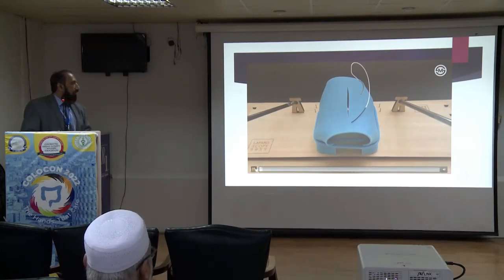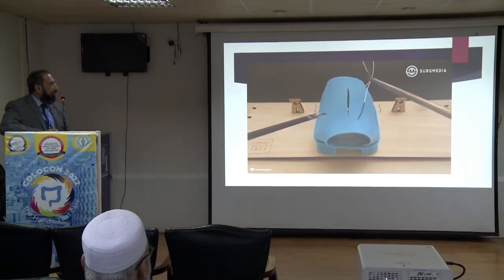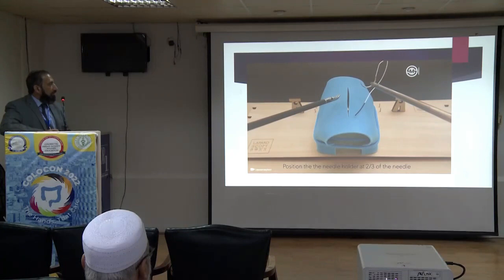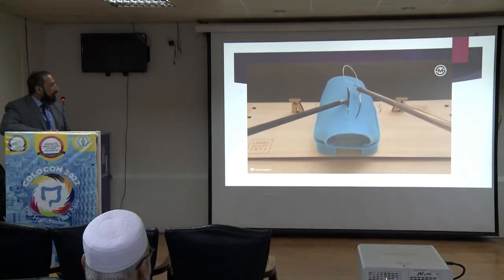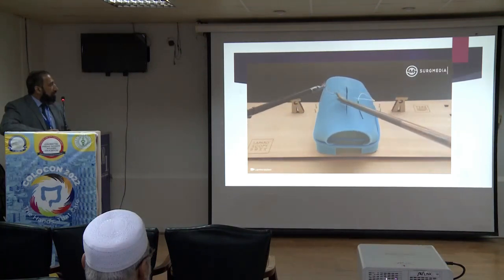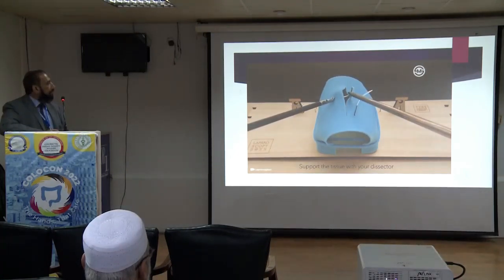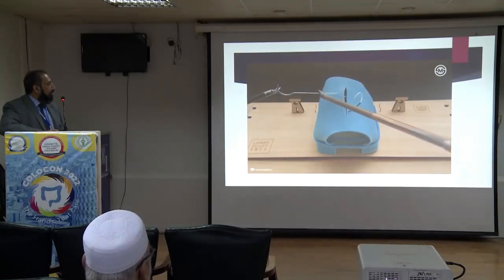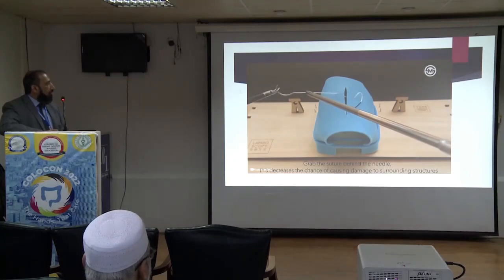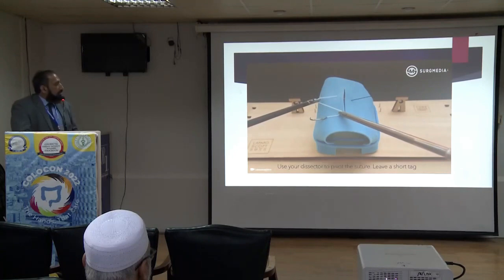This is the video which shows how it is done practically. The needle is grasped by the needle holder at point C. Tissue is displaced in order to create some space. The needle is entered at 90 to 70 degrees from the tissue. The needle follows the curve, is grasped by the other instrument, and resetting is done. The same technique is applied on the other side. The assisting instrument now becomes a pivot and prevents damage to the tissue by the thread.